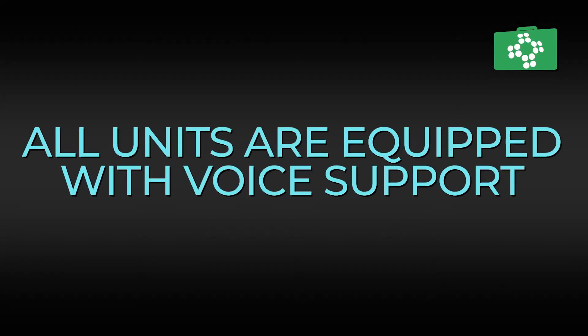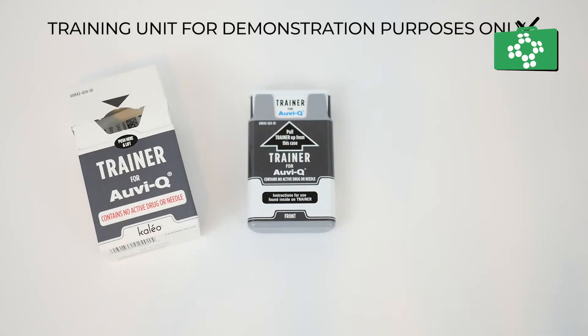All units come equipped with a set of voice instructions, so the unit will literally tell you what you need to do. Should this part of the unit malfunction however, the unit will still work as an autoinjector, meaning you can still use it to inject the drug.